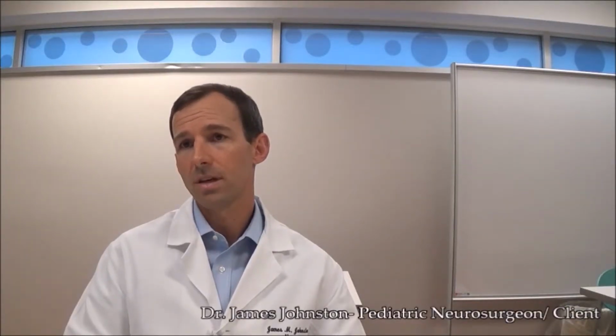In endoscopic neurosurgery, the number one limiting factor is bleeding, visibility, and the ability to control that bleeding. It's a major issue. It's not uncommon for us to have to stop a procedure short of our goal because of recurrent bleeding that we can't really stop, or where we get bleeding that requires prolonged irrigation lasting 10-15 minutes or even longer, and those prolonged periods of time increase the infection risk for the patient.